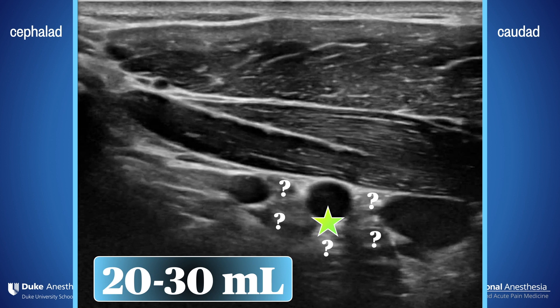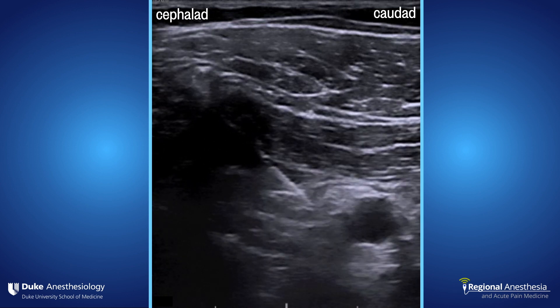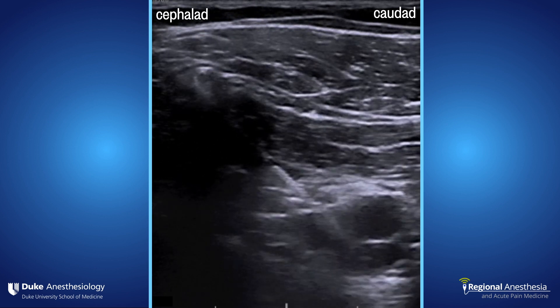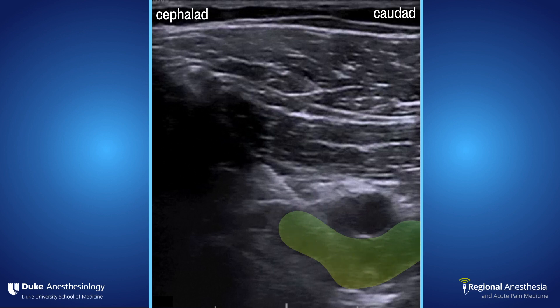We'll typically use between 20 and 30 mils of local, depending on the patient's size and the pattern of spread. Here's an example of why it's not crucial to see the cords — I can maybe see the lateral cord in this image, but I wouldn't bet my life on it. That's okay, because the goal is to hit that six o'clock spot. You can see the local lifting the artery up and spreading in a U-shaped pattern — this is what you want to see.